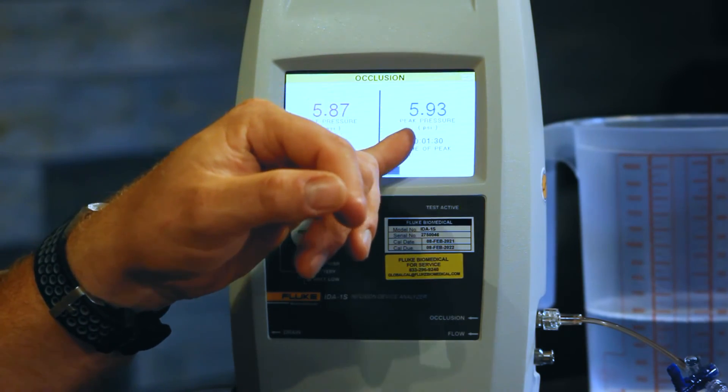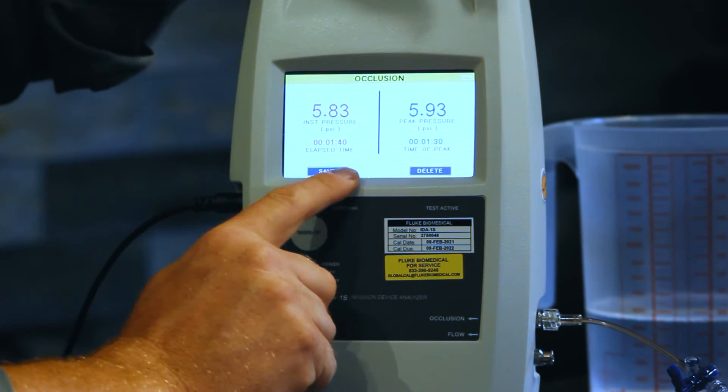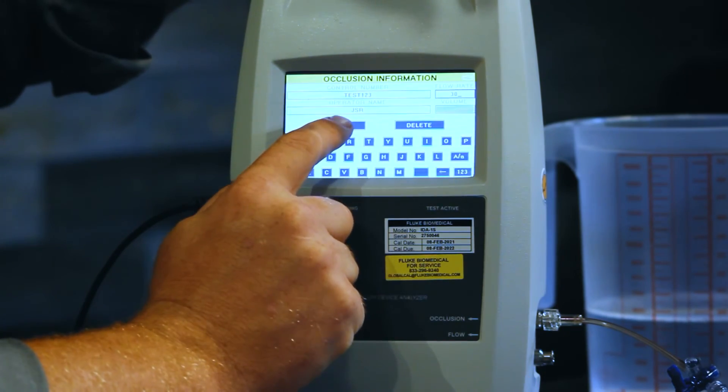The infusion pump alarmed and our peak pressure was 5.93 psi. It took a minute and 30 seconds. So I'm going to go ahead and press end and save that data. Now, something I want to tell you about the IDA1S — this can be operated on battery. A little tip: when you're done with that test, relieve the pressure from that pressure transducer. So we open the stopcock — you saw some of the fluid come out. That relieves the pressure on that pressure transducer, which is going to extend the life of your battery.